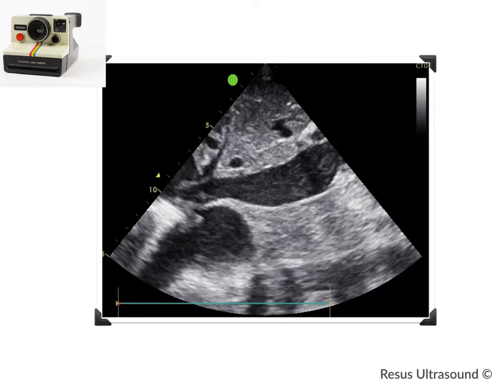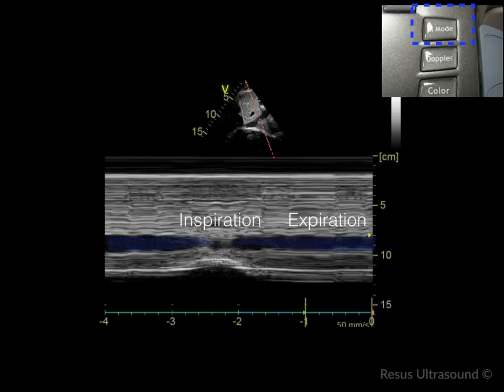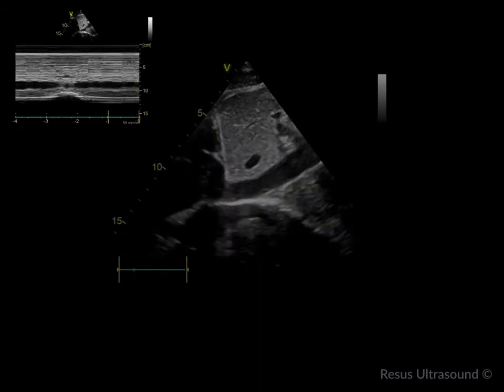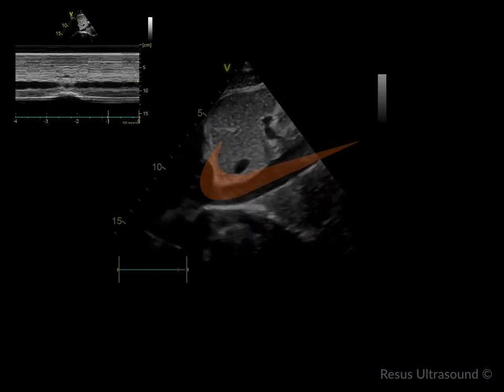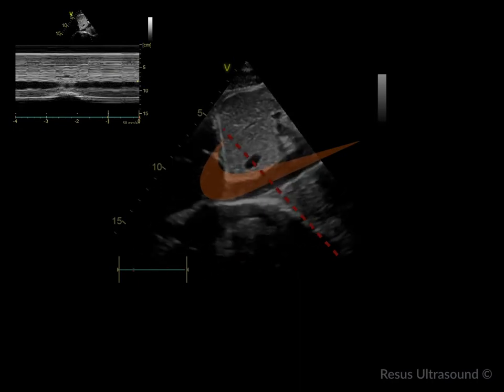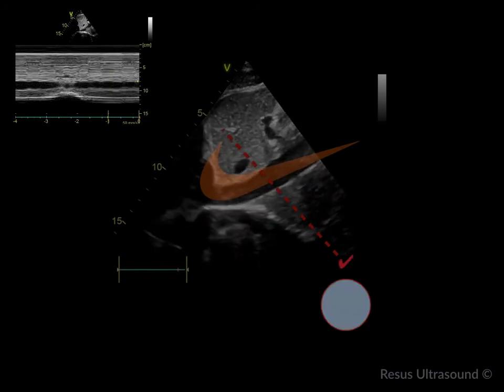If you want to capture a picture of the IVC to send to a doctor showing whether the patient has a large or small IVC, there is a technique using M-mode. When you push this button, it captures the picture of the IVC in two phases — inspiration and expiration — over time. The blue tube in the picture depicts the IVC tube varying in diameter between inspiration and expiration. To use M-mode, place the M-mode line perpendicular to where the tube appears as a straight line — essentially cutting the IVC in half.